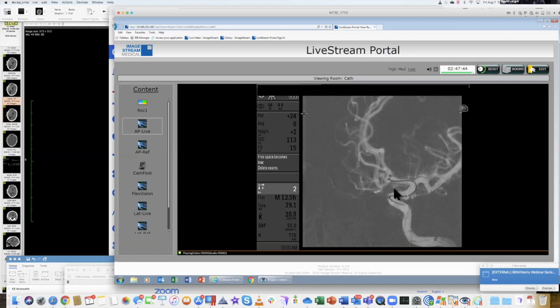And if there are any questions, Josh, I'm happy to answer them. You guys doing this in real time? Yeah, this is really happening right now. Live aneurysm coiling. Absolutely incredible.